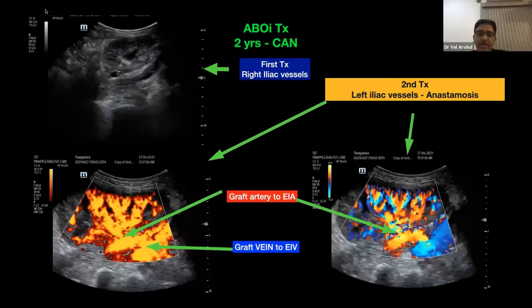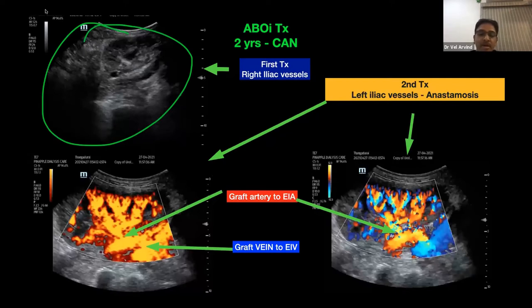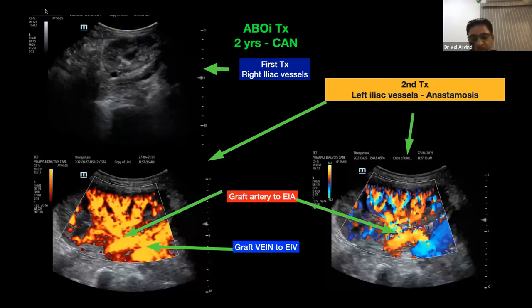Here I've shown you the graft of a second transplant, the top upper corner is the one. Here I just marked, that is an old graft actually. That patient underwent an ABO incompatible transplant. Later, he rejected it. Then his nephew gave a donation, and this is the external iliac. Whenever we go for a second transplant, we prefer the external iliac. That's our choice, even though the previous one was external, we always prefer the external, even though there is a good internal iliac artery, for fear of gluteal ischemia and other things.